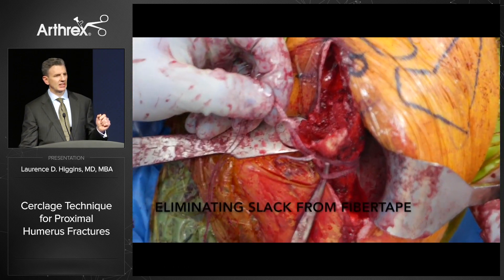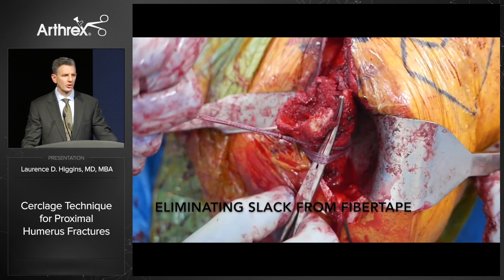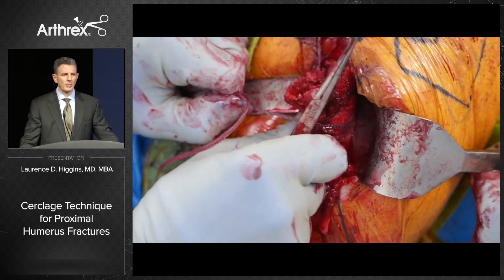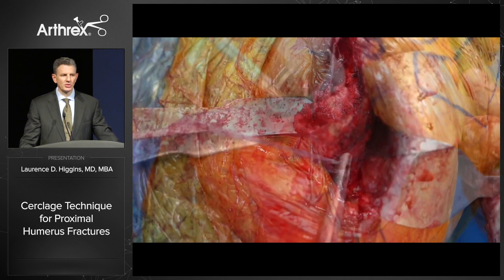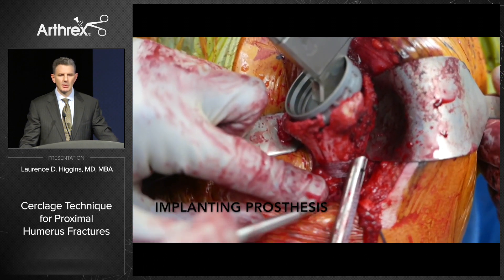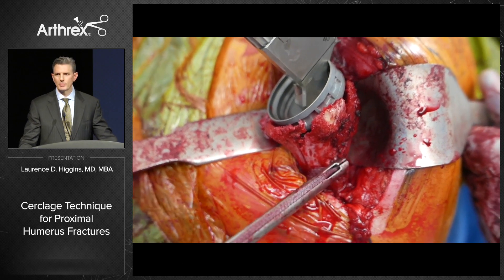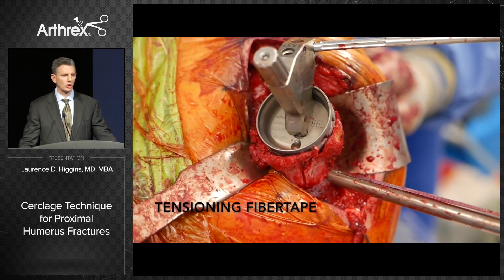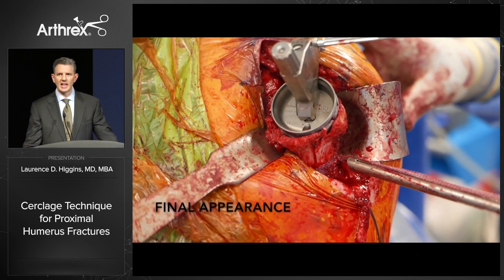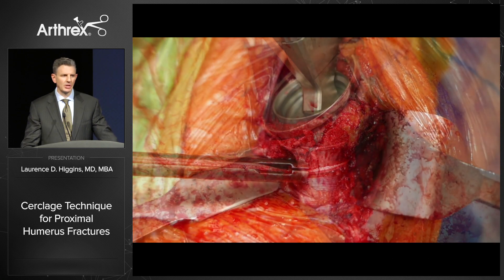What's nice about the fiber tape in this application is that it has a lot of friction compared to wire and tends to stay at a higher position. We take the slack out of the construct, attach it to our tensioner, and tension to about 40 or 45 pounds, impacting with the tensioner in place. This allows us to regulate exactly how much tension we want, as tension can go up to 80 pounds — a dramatic amount that you cannot achieve by hand. We've tensioned it and there's still a small gap but complete lack of propagation of the split below it, and the final appearance shows we've closed that gap down somewhat.